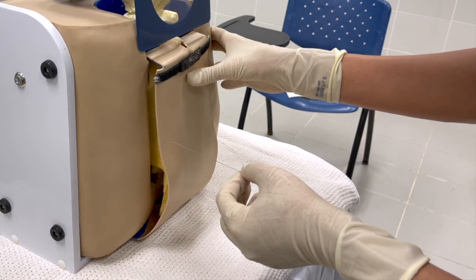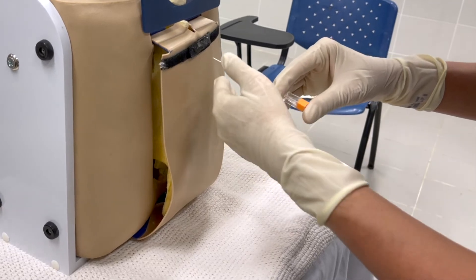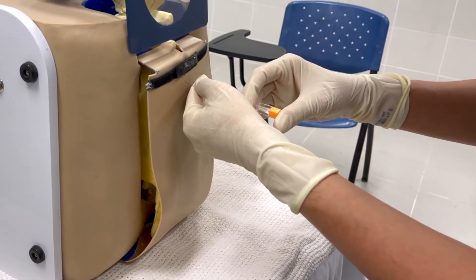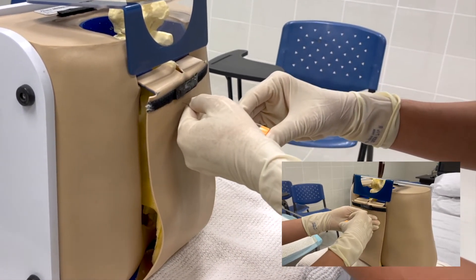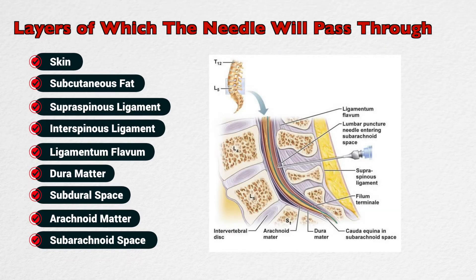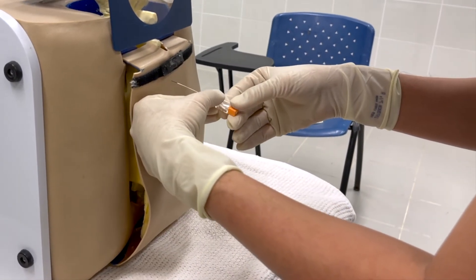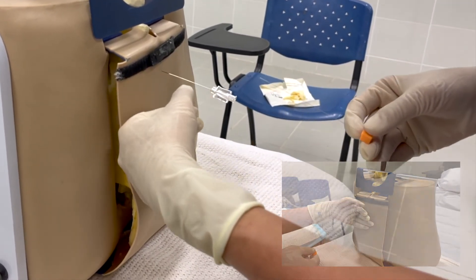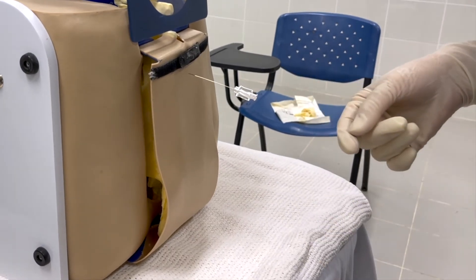Mr. Najib, we are going to insert the needle now — you may feel a bit of pain and discomfort, but I will do it gently. With the spinal needle perpendicular to the intervertebral space — once you have identified the space, you will see the CSF flowing out, clear and colourless.